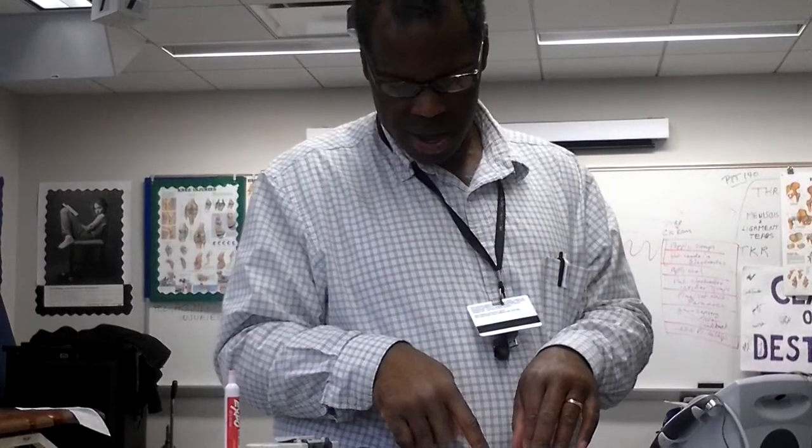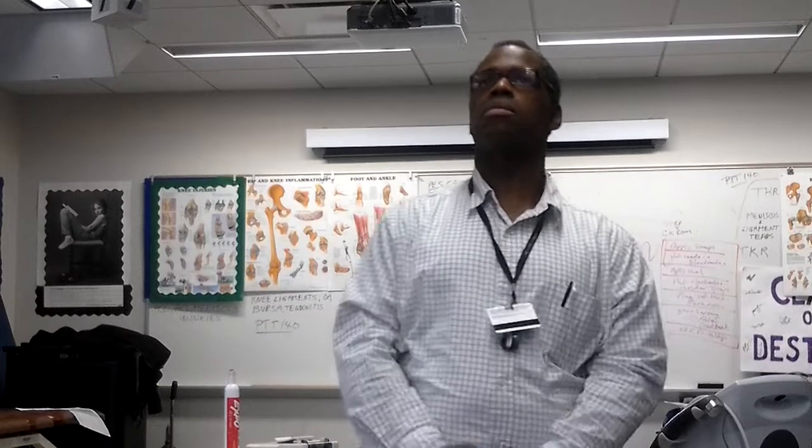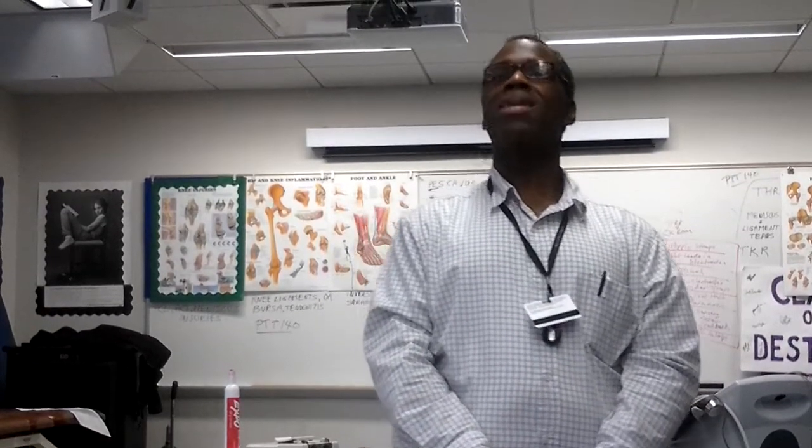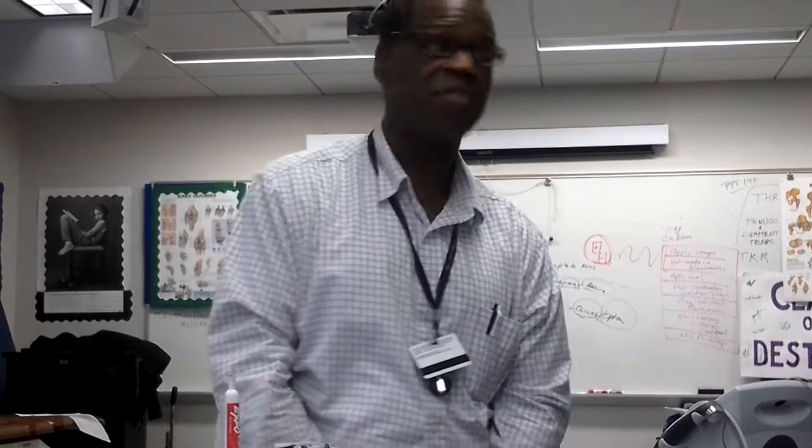All right, taps. What pulse rate could we turn the machine to get taps? 2 to 4. What do I need to put the pulse width at to get taps? 50 or below.